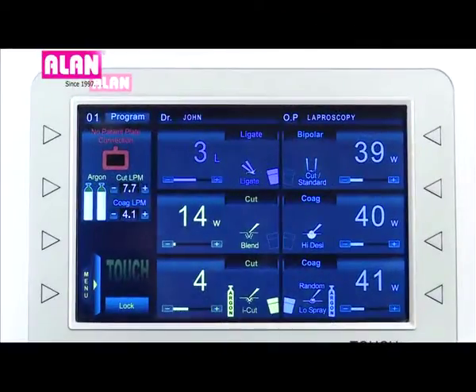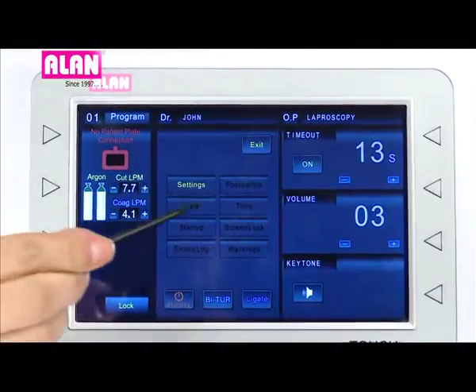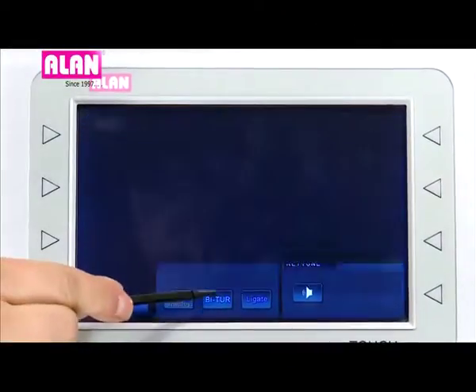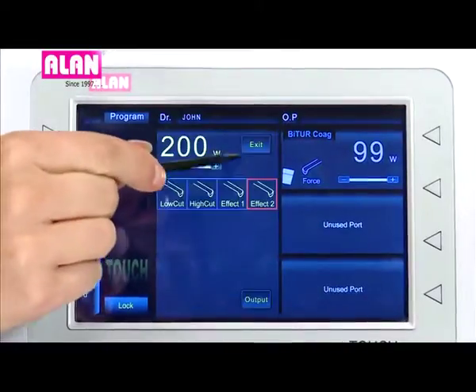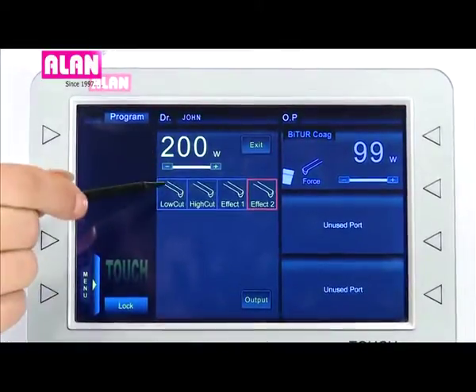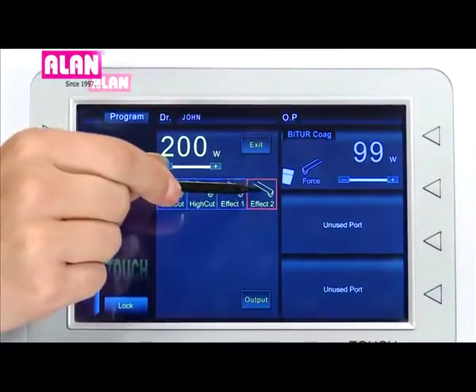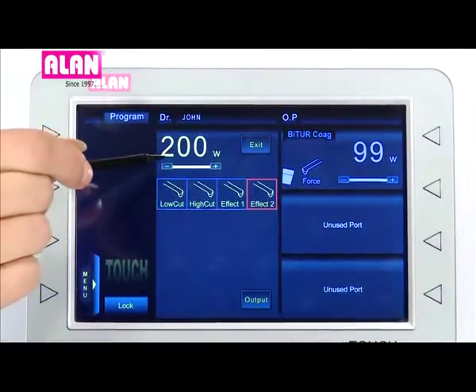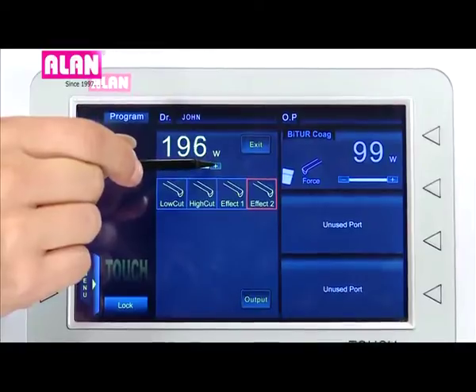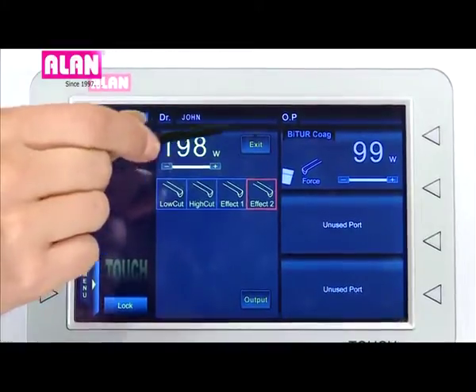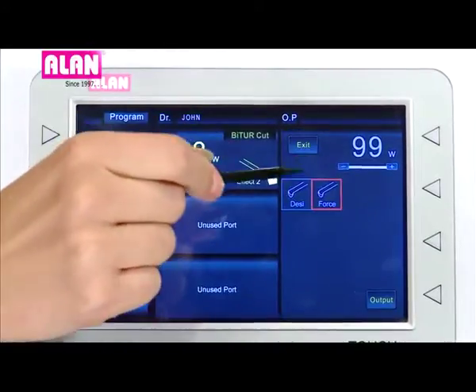Right now we are in standard mode. To switch to BiTUR mode, touch the menu icon and then the BiTUR icon. The unit will automatically initialize itself for BiTUR mode. Now we are in the BiTUR window, where power levels and mode selections can be done for cut and coag.